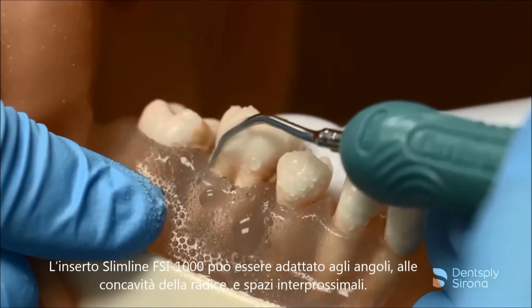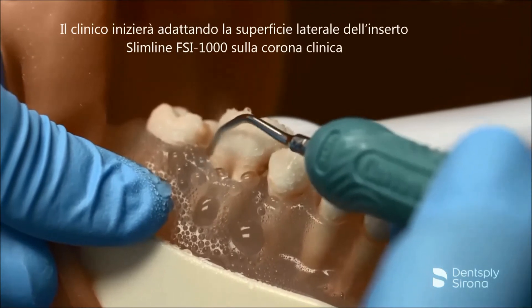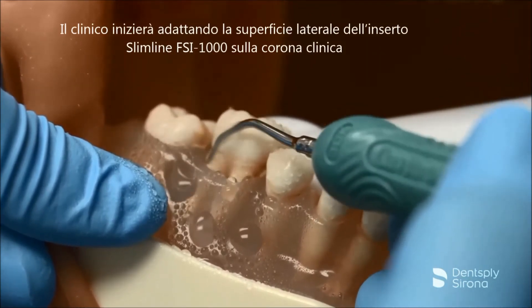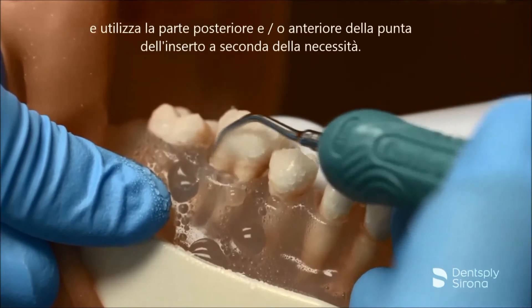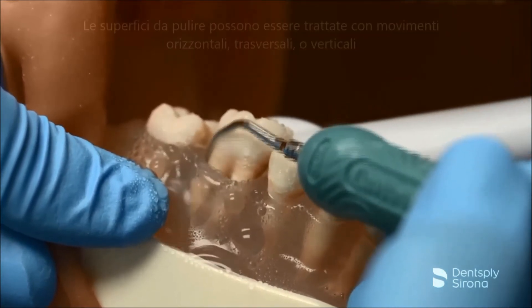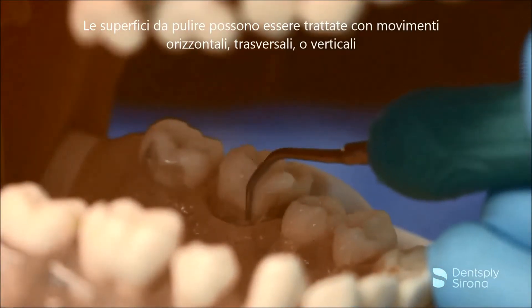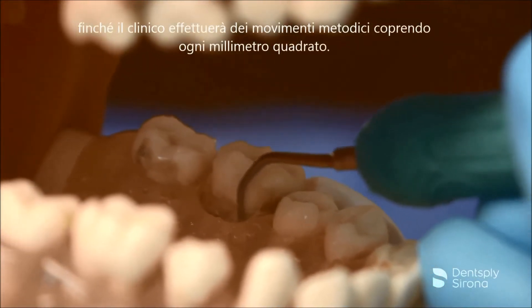The Cavitron FSI Slimline 1000 can be adapted at the line angles, the root concavities, and interproximally as well. The clinician will start by adapting the lateral surface on the clinical crown and uses the back and/or face of the insert tip as needed. Strokes may be performed in a horizontal, transverse, or vertical direction as long as the clinician is methodical and covers every square millimeter.